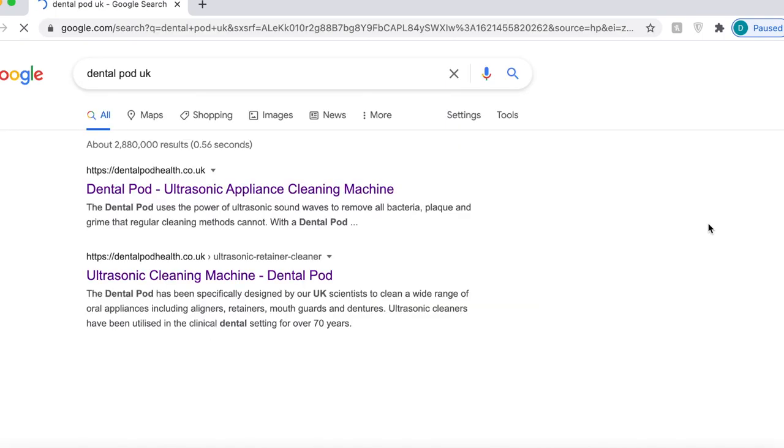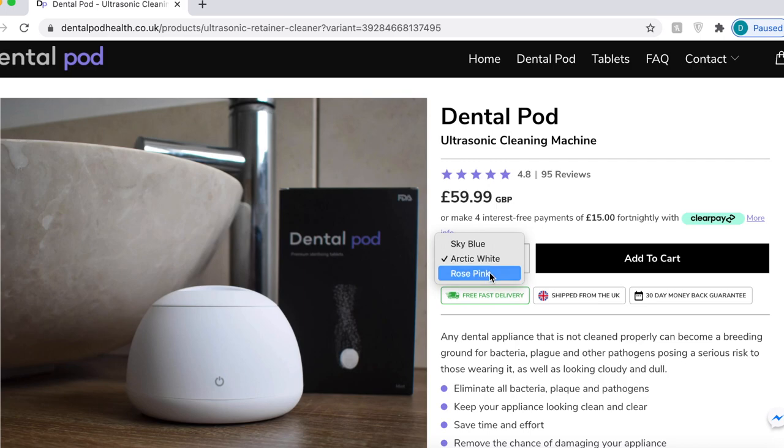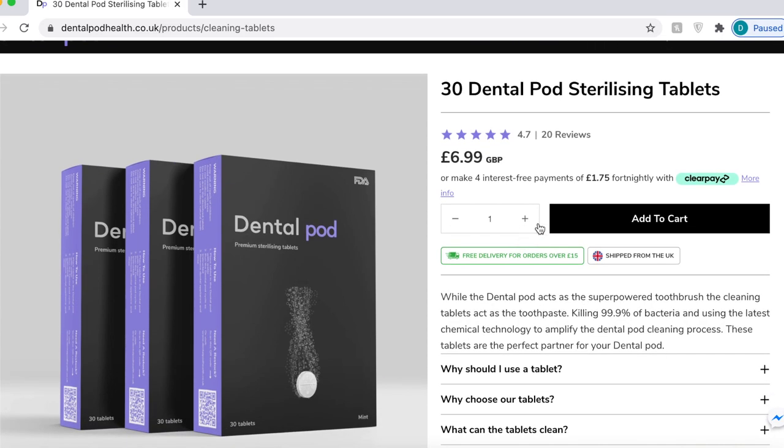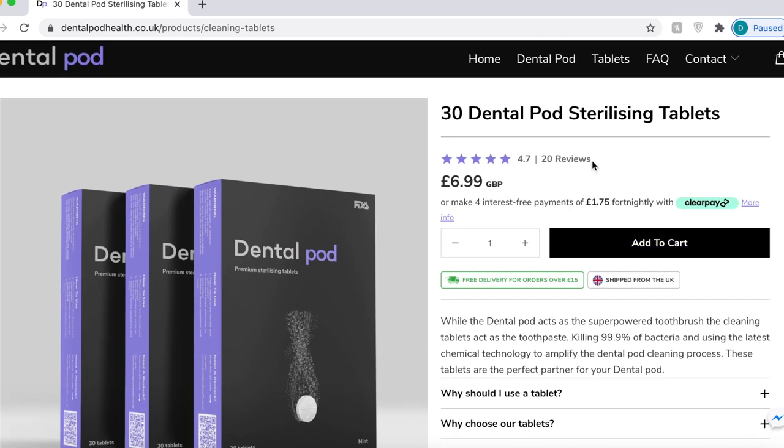I wouldn't recommend a product I don't already use myself — I've been using this now for a few months on my own retainers. I don't use it every single day and I probably wouldn't recommend that you need to either. Once every few days is fine, depending on how often you wear your retainers or Invisalign trays. I'd say once or twice a week works well, and the tablets last longer that way. The pods are £59.99 on the Dental Pod UK website and came with 30 tablets included. The tablets are £6.99 and last you 30 days.